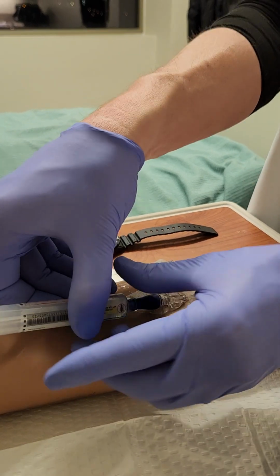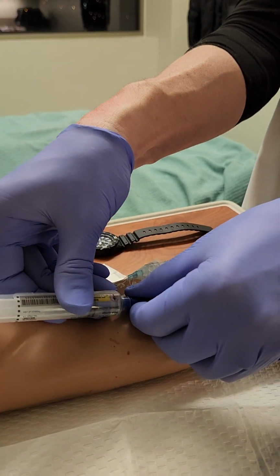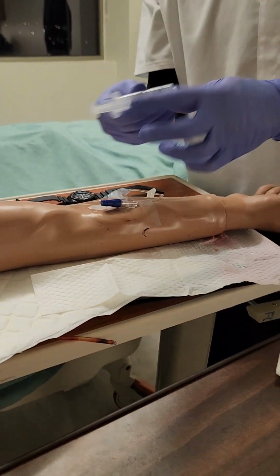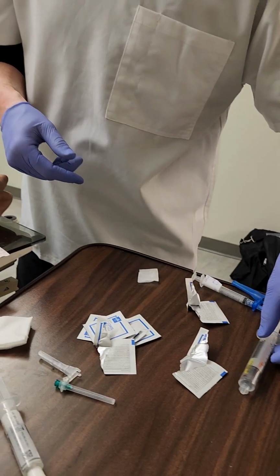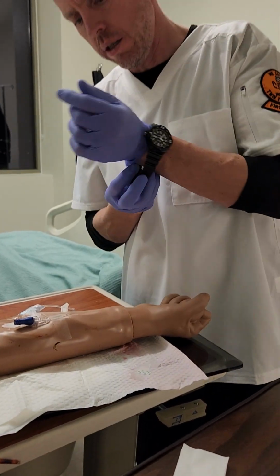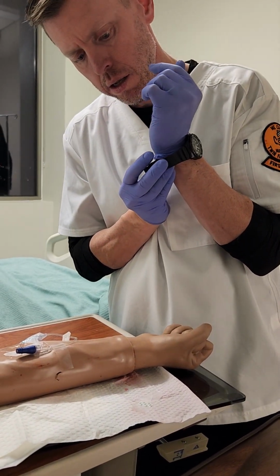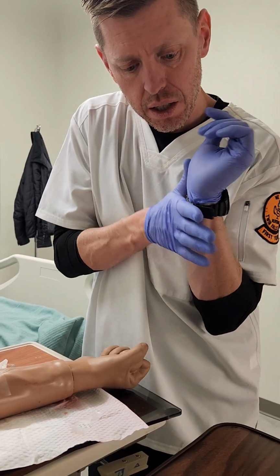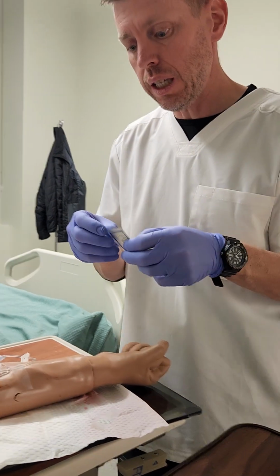That's pretty cool. Good job. You took that like a champ. All right. So now I'm not going to attach anything else to it, but I still want to clean this up afterward.